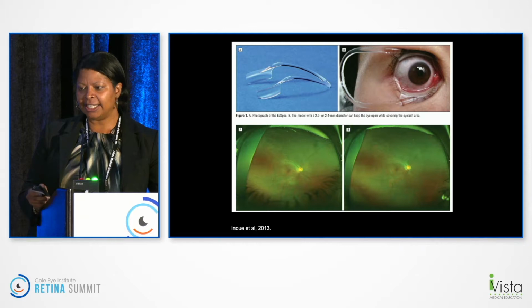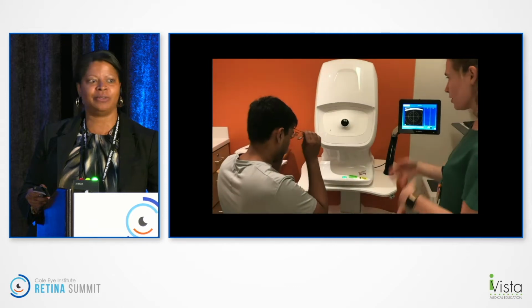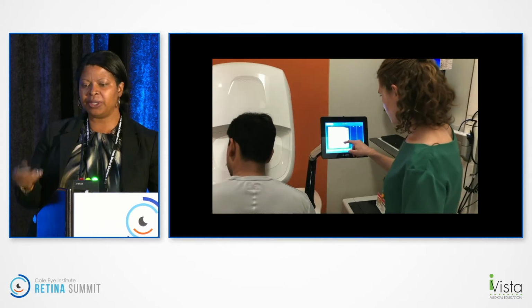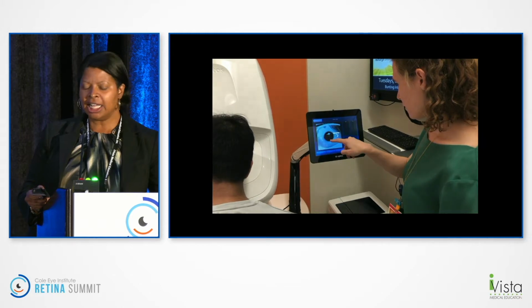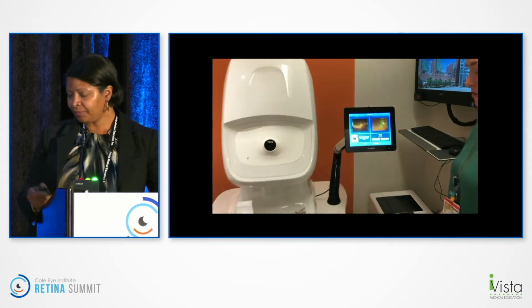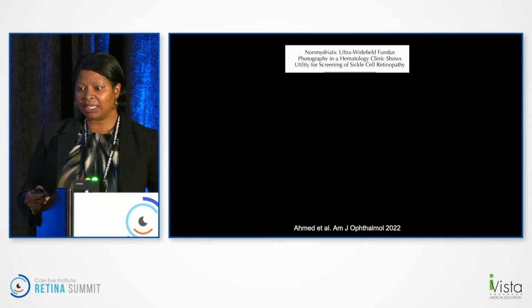The sickle cell retinopathy screening guidelines are somewhat amorphous, so we see a lot of patients who don't necessarily have actionable sickle retinopathy. So we put this Optos ultra-wide field primary camera in the hematology clinic. This is a medical student and a study coordinator taking pictures. It's that quick, it's non-mydriatic. We had just brief training from the company itself, but they take decent pictures.